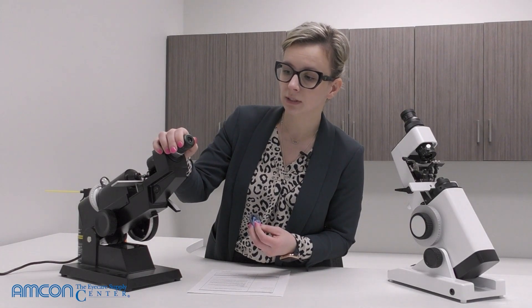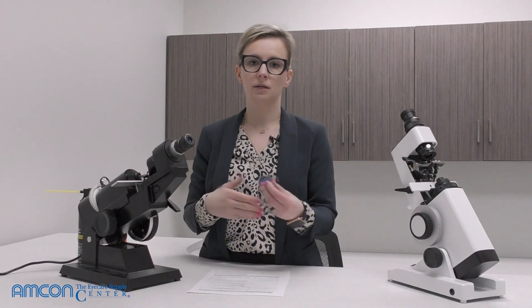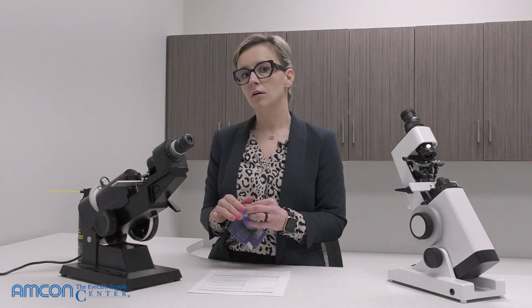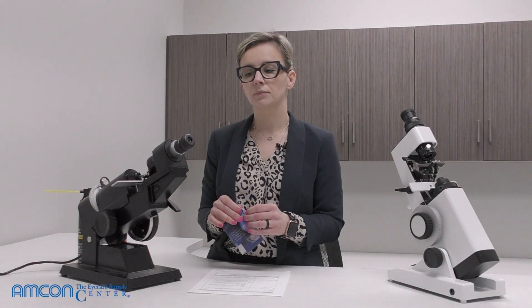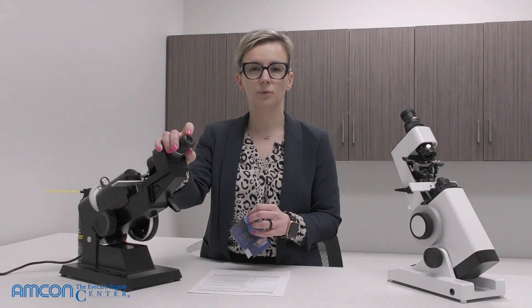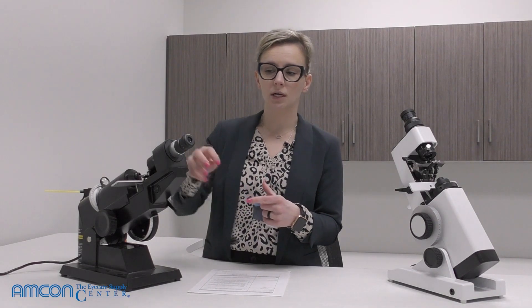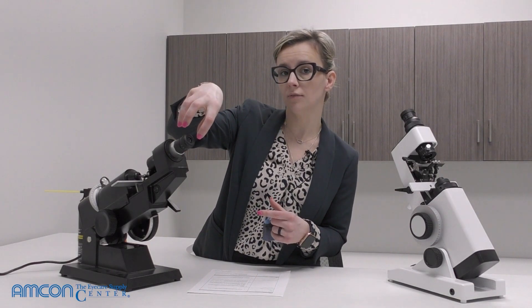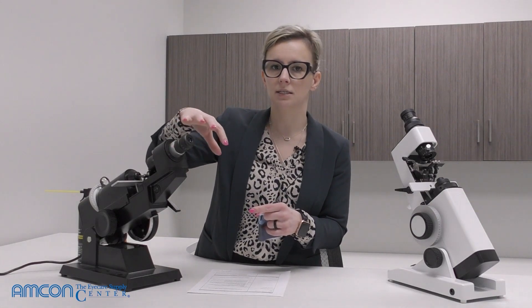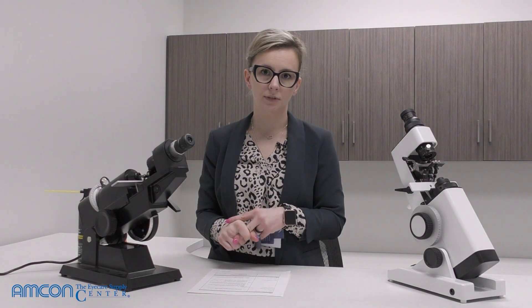You'll know if you cleaned it properly by looking in and seeing no smudges — it'll be nice and clean. I wouldn't suggest using alcohol on your eyepiece or the lens, because we don't want alcohol settling around the edges where the lens meets the eyepiece and causing damage to the metal or the glass.